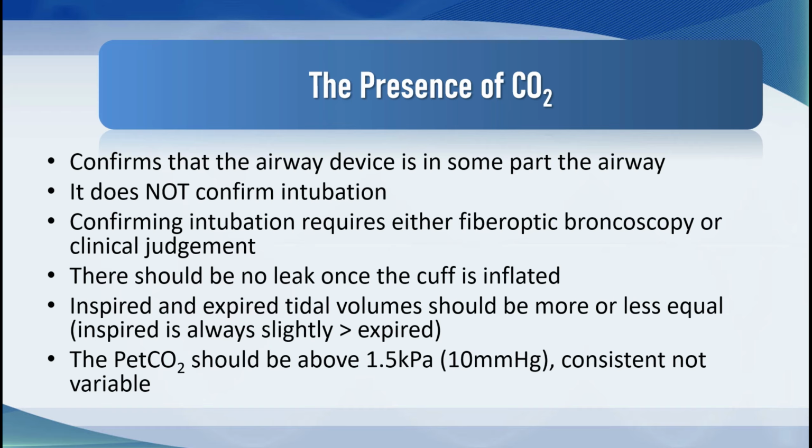Confirming intubation is quite controversial. In my view, the only way to truly confirm intubation is to put a fiber optic scope down through the tube and see the carina. For most of us, most of the time, there is a degree of clinical judgment. There should be no leak once the cuff is inflated. Inspired and expired tidal volumes should be more or less equal.